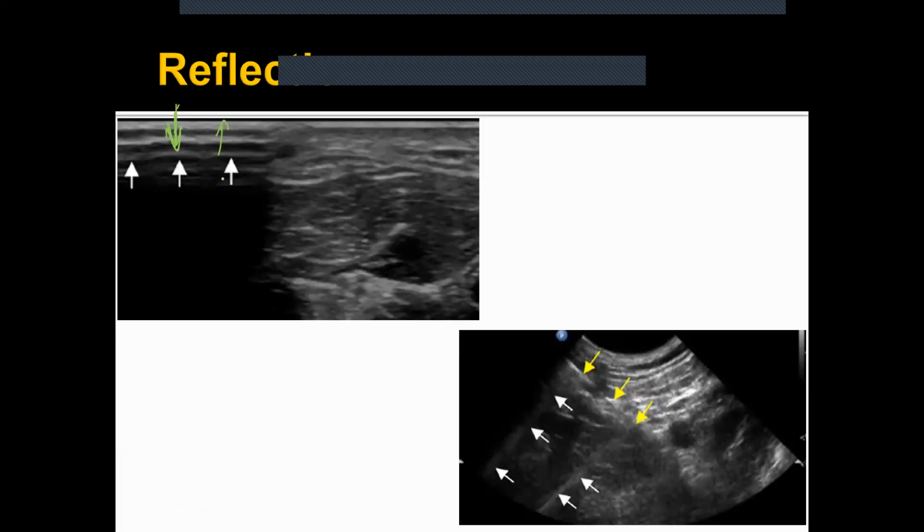All right, so this here could be, for example, a bone at the top, and that might be causing that, such as if you're looking at the ribs. Or it could be a change in the surface if, for example, the probe isn't properly aligned, and so forth. Now, similarly here, there's an object over here, there's a line.